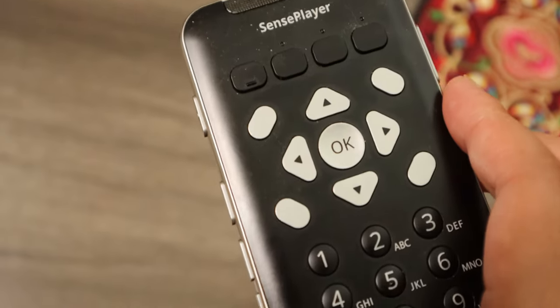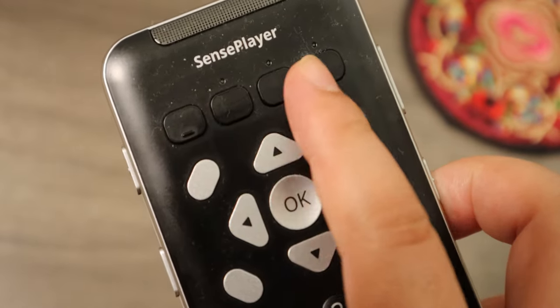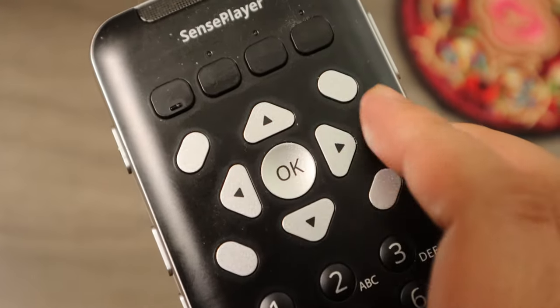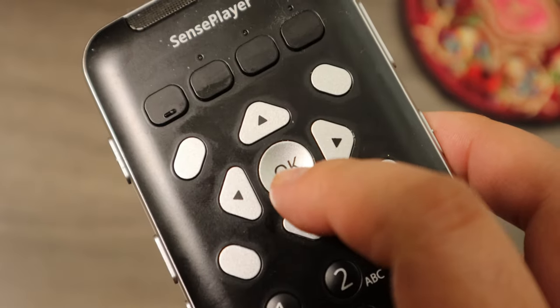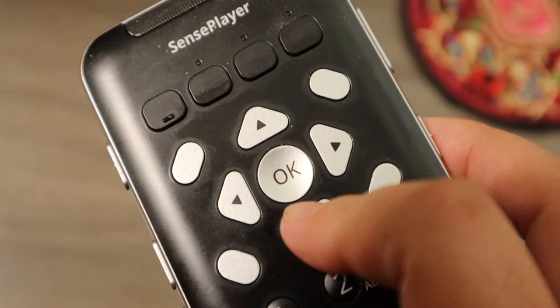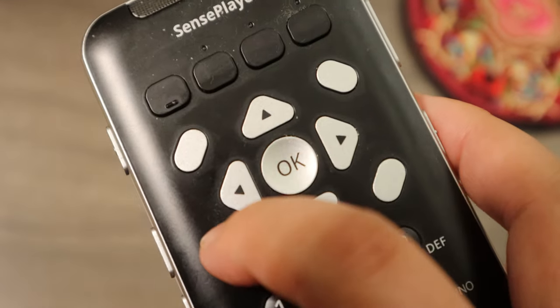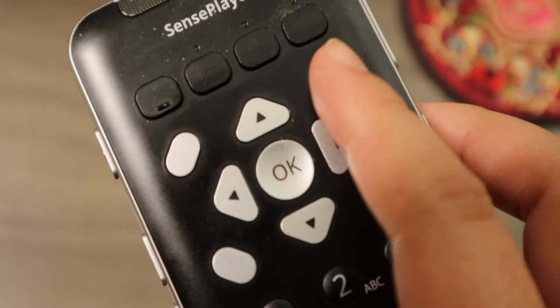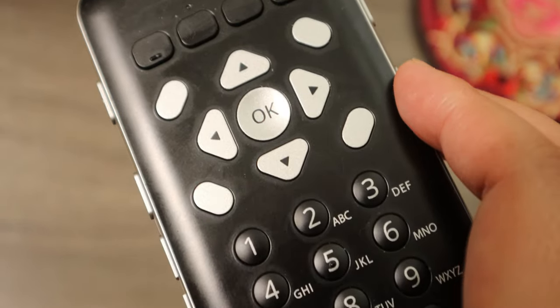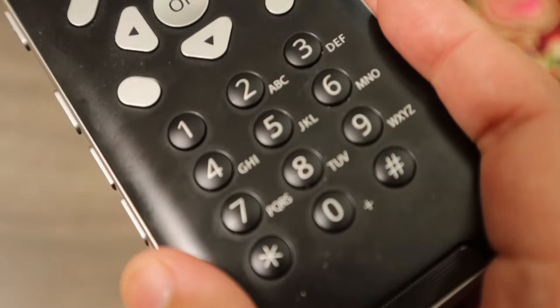Let's quickly go over the layout of the device. Most of the buttons are on the front face. You'll feel four buttons at the very top, and the first button all the way to the left has a tactile marking. Right under that are your navigation buttons. Right in the middle is a circle button with a bit of an indentation, which makes it really easy to feel and find. Around that circle is an up arrow, a down arrow, a left arrow, and a right arrow, and then around those are four other buttons. On the top left is your home key, top right is your menu key, bottom left is back, and bottom right is delete.